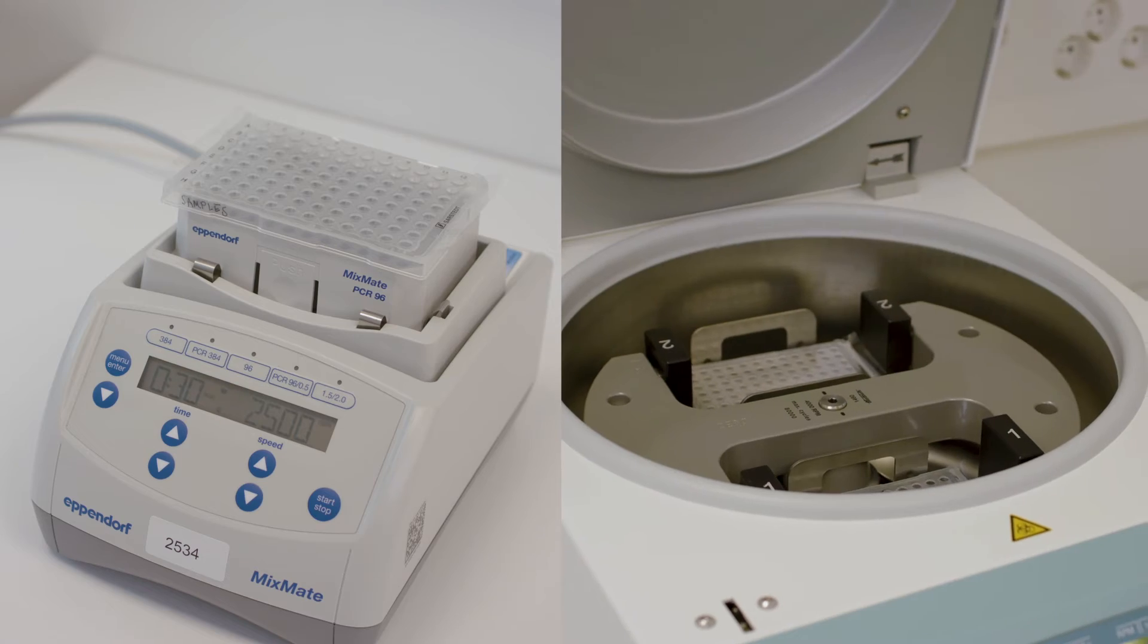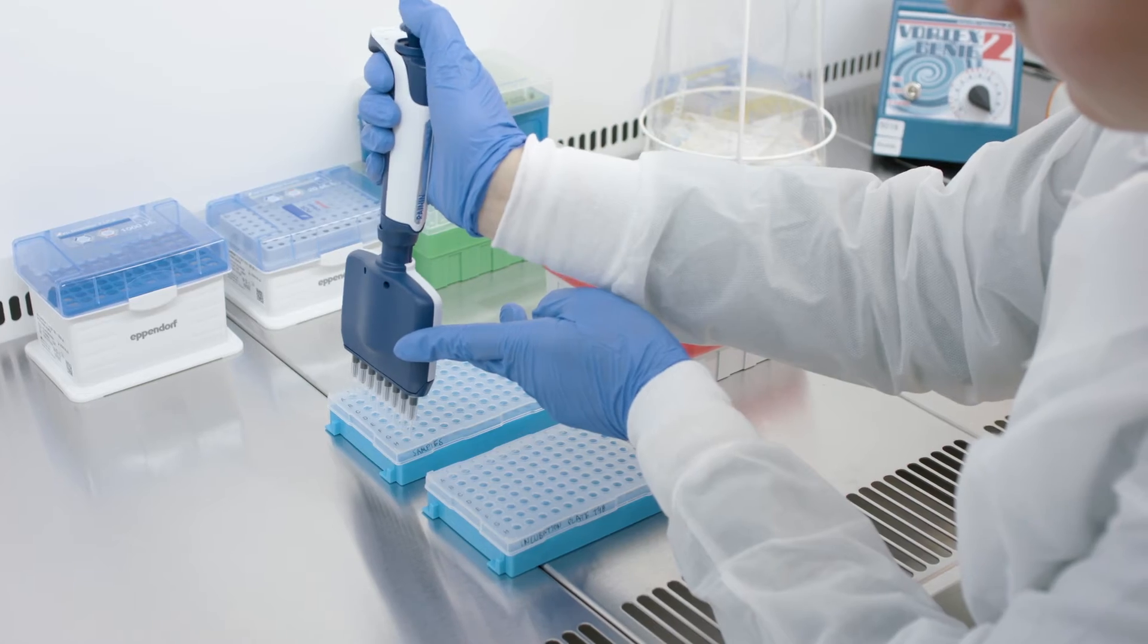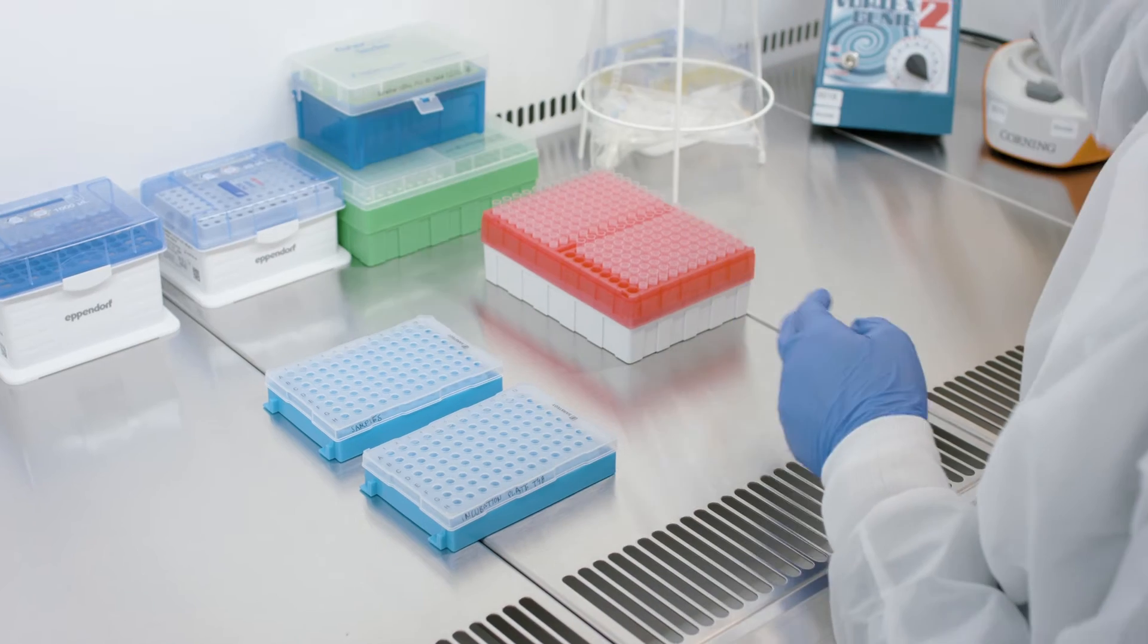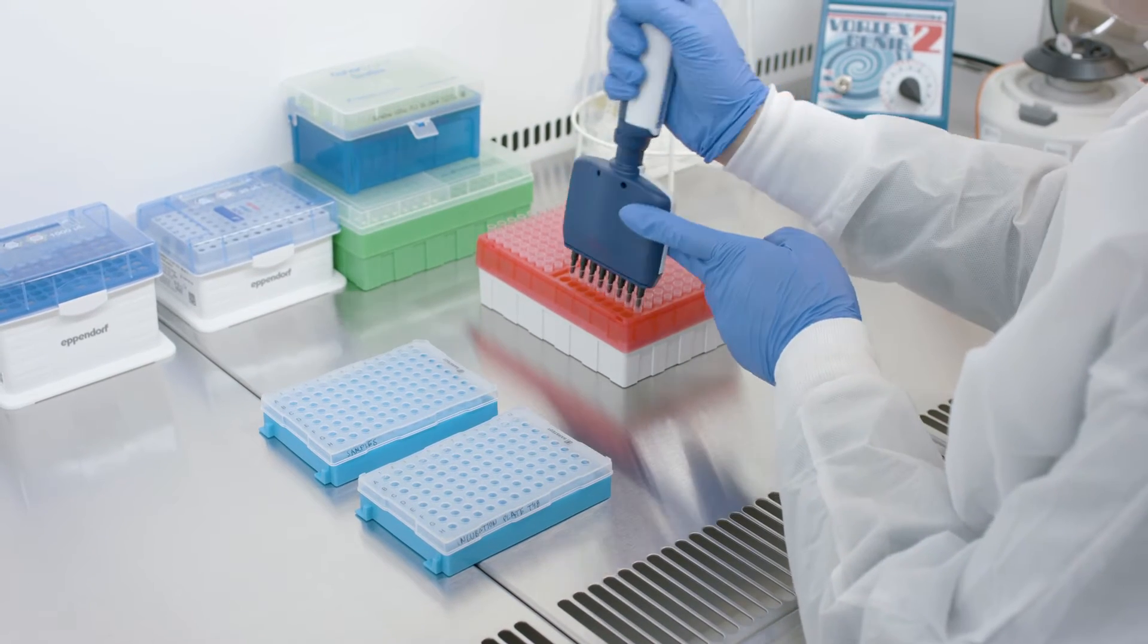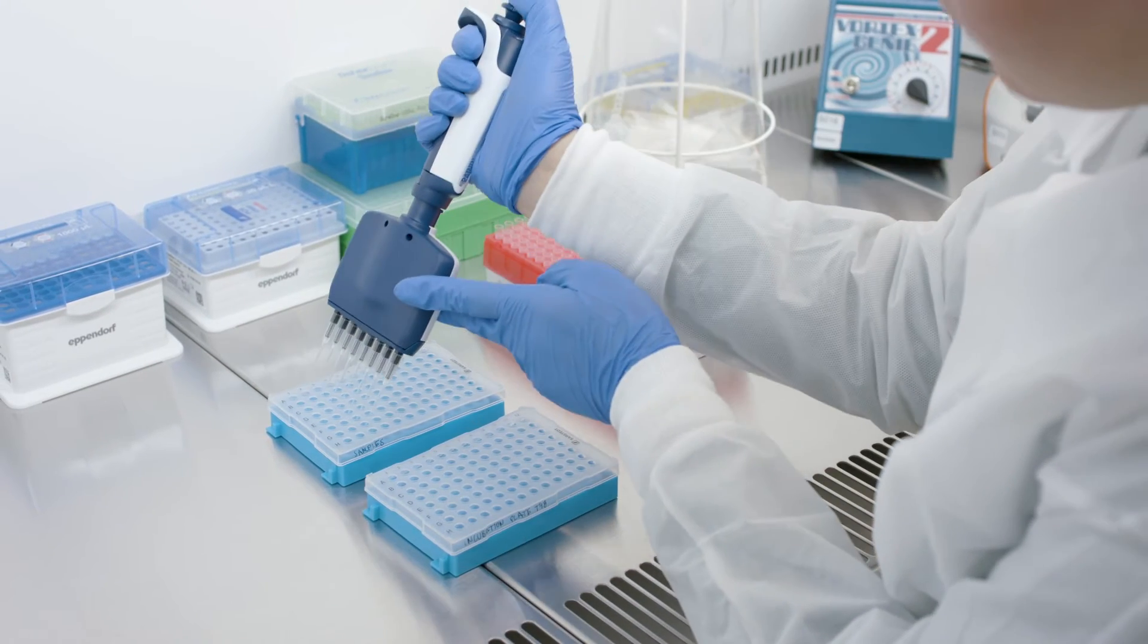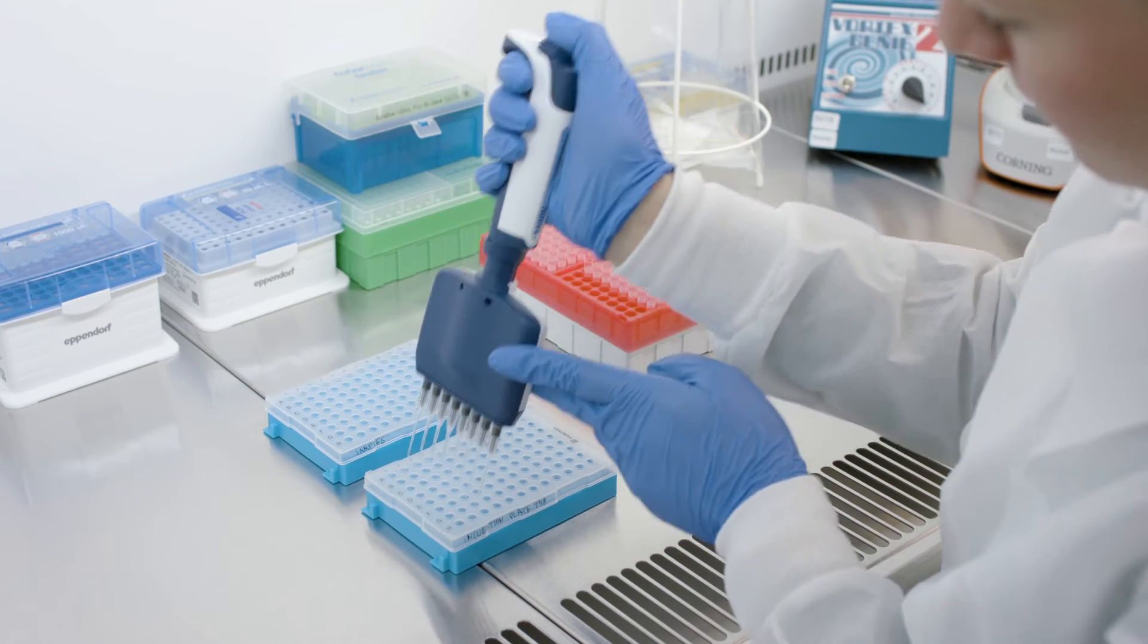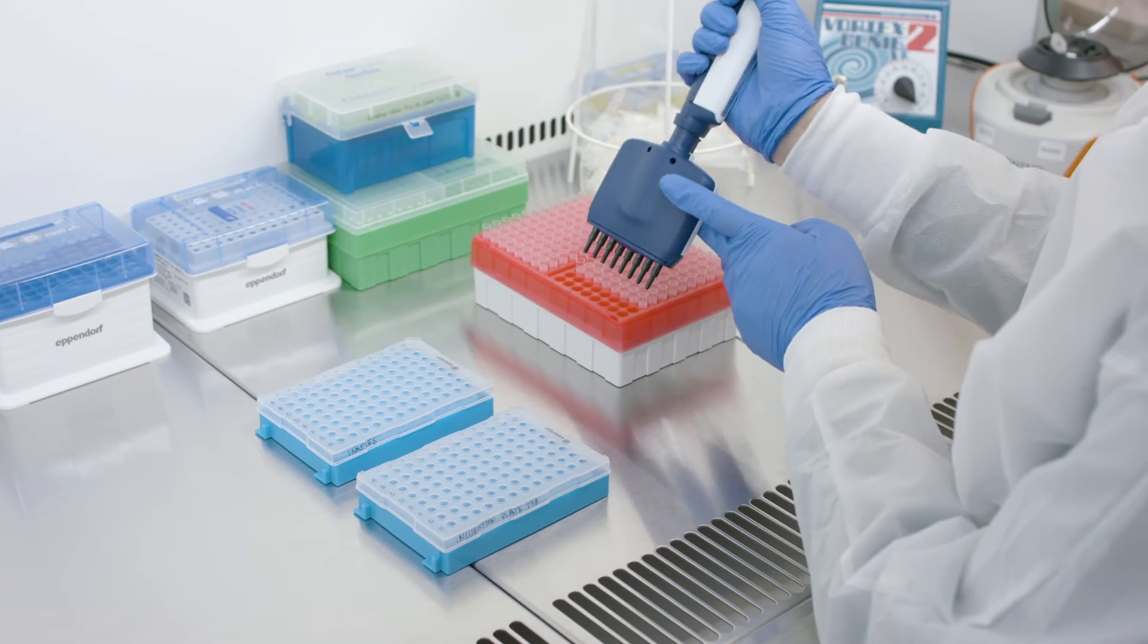Vortex the samples and spin them down. Transfer one microliter of each sample to the bottom of each well of columns one to five of the incubation plate, according to your sample plate layout, using a multi-channel pipette and forward pipetting. Make sure to change tips between the columns.